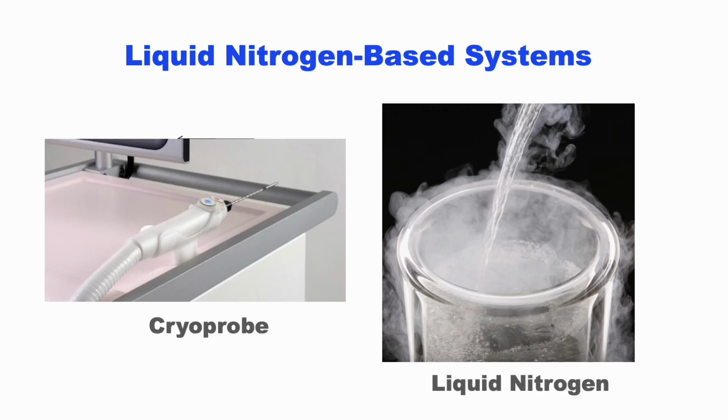Now, although multiple cryoablation systems exist, the more user-friendly office-based system utilizes a single disposable cryoprobe through which liquid nitrogen circulates during cryoablation. However, we do have the ability to perform multiple consecutive overlapping cryoablations to achieve a larger volume of necrosis than is achievable with a single ablation.